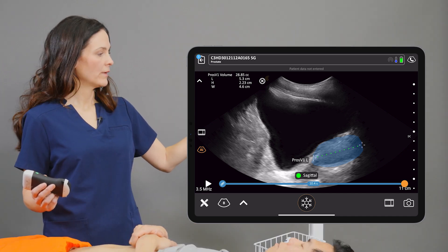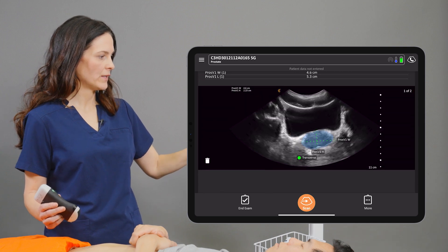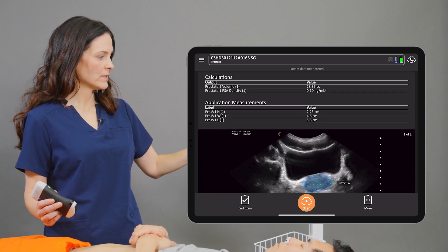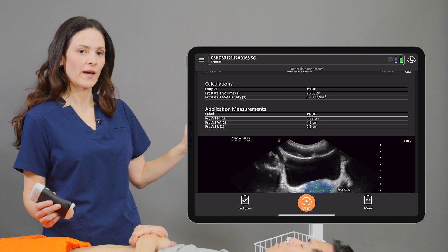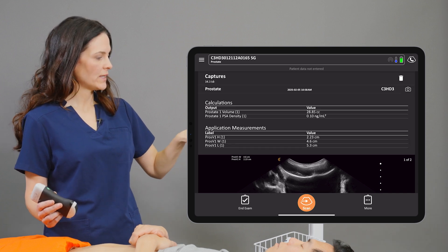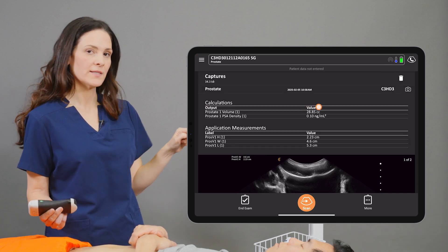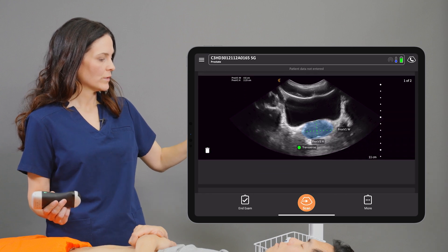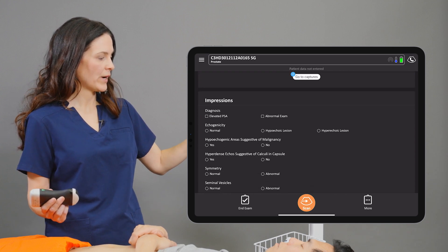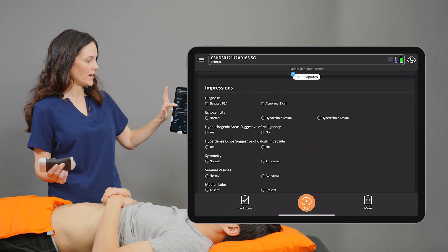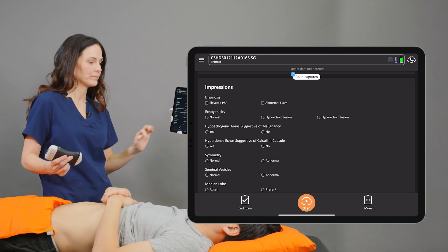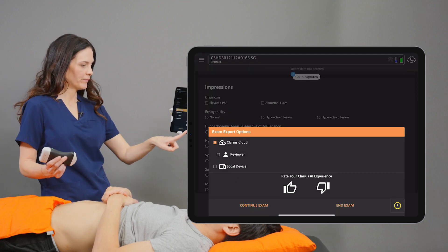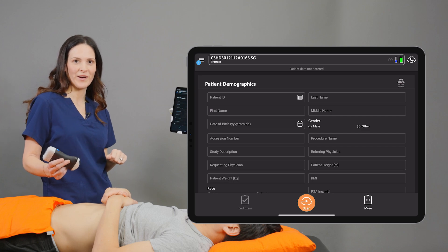We'll tap the back arrow and head back to the patient demographics page, where we can review our images, our measurements, and any of the calculations. We can also see here that the PSA density has been calculated for us. We'll scroll down to the impressions heading and here we enter any findings from our scan. We can tap the end exam button and we've completed our prostate study.